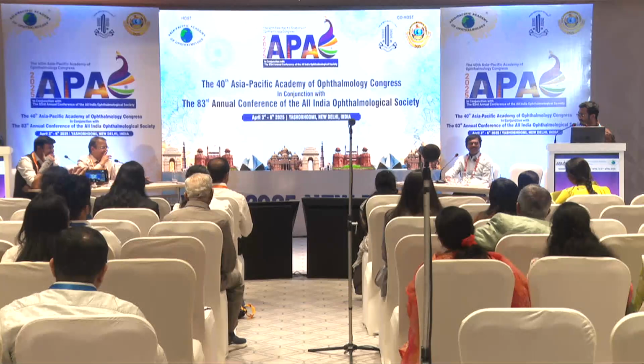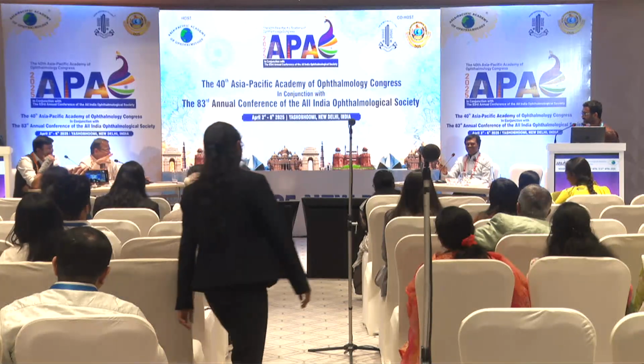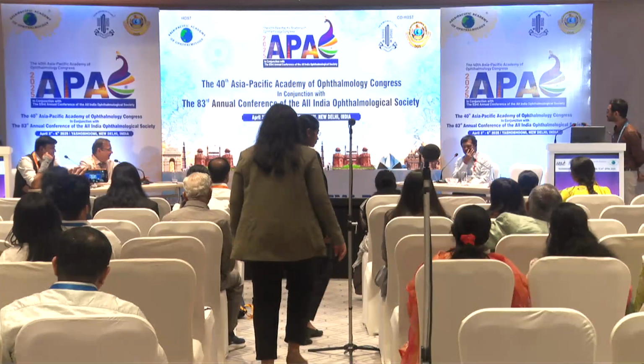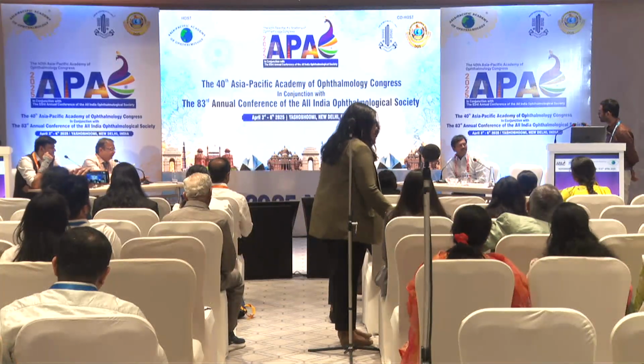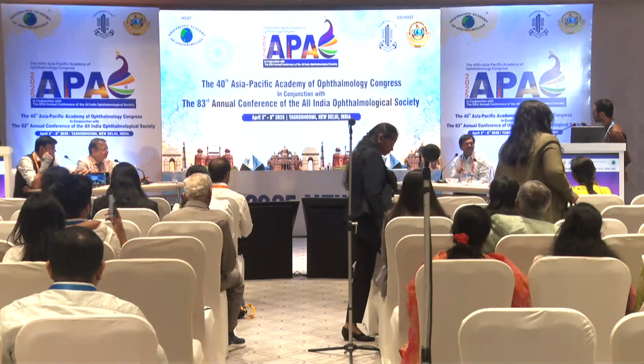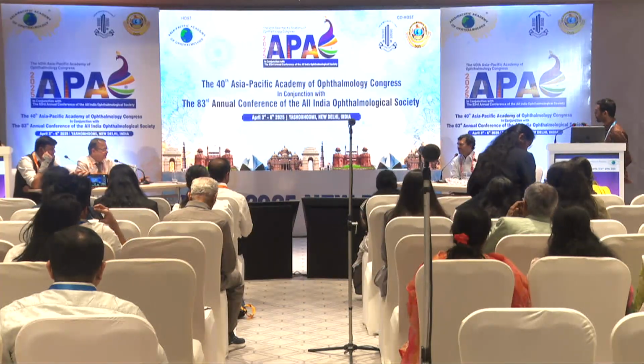An inferior PI was done. Basically, you do the inferior PI to prevent secondary glaucoma, and with positioning at the time of filling the oil, you make sure that it doesn't come into the anterior chamber. Overfilling should not be done.